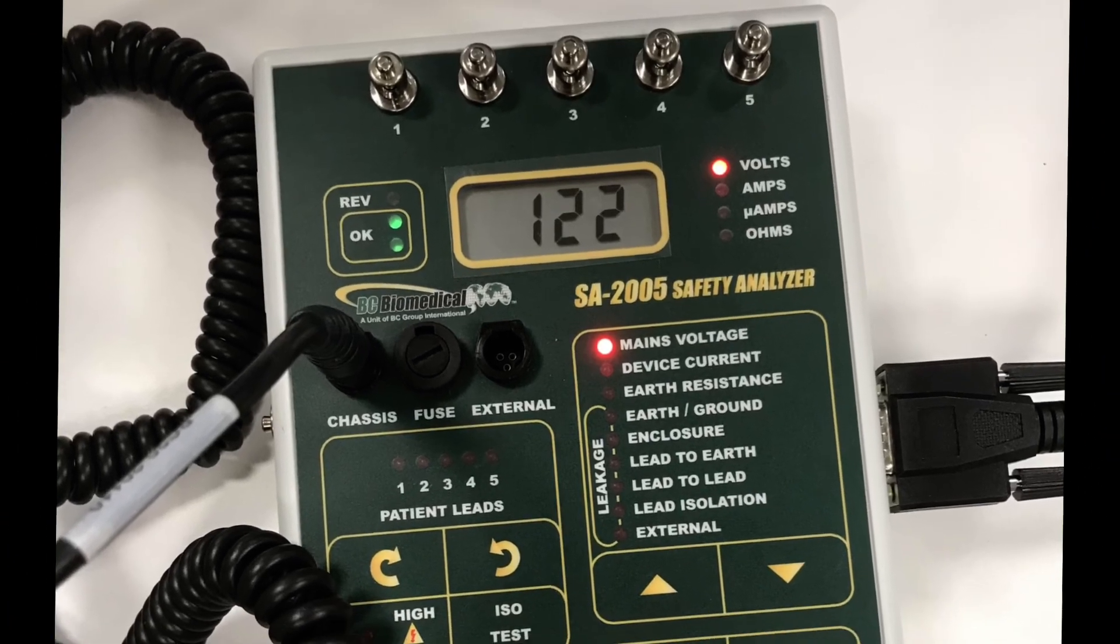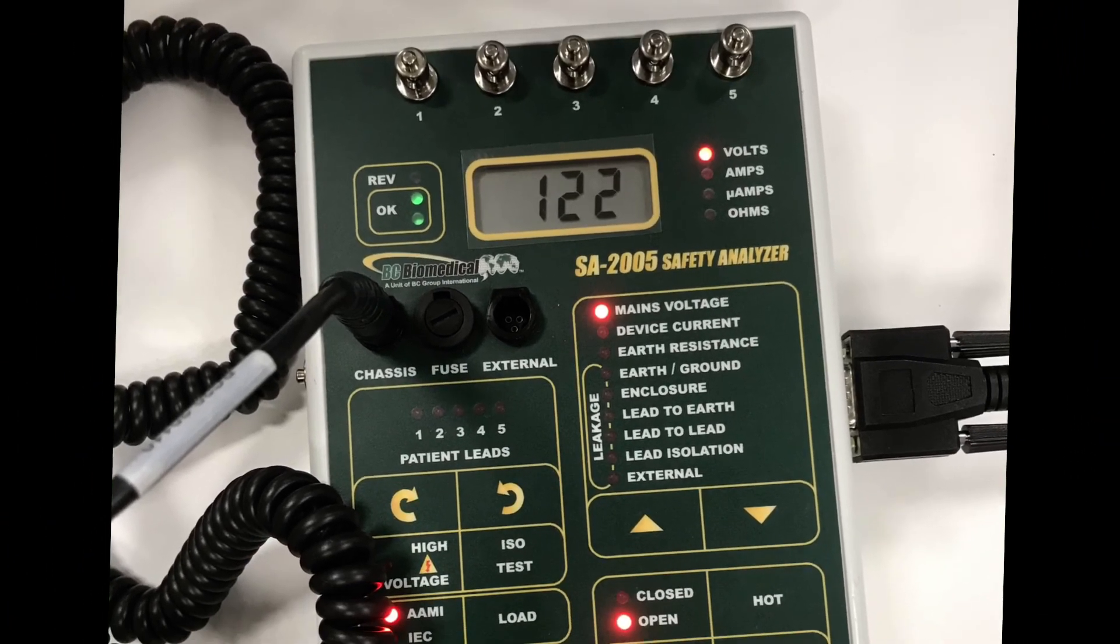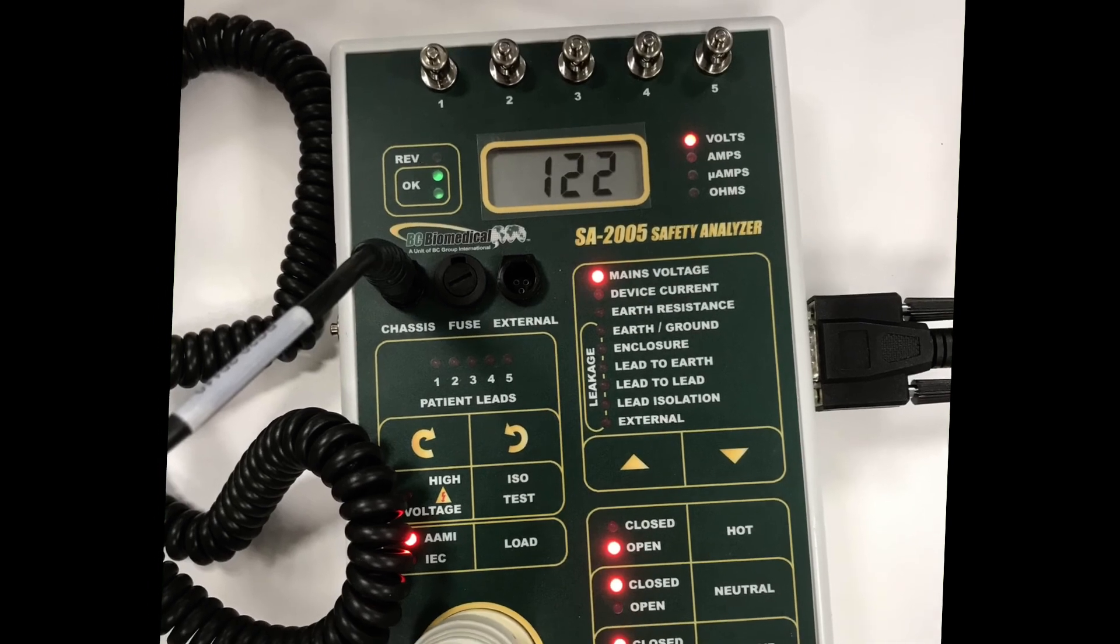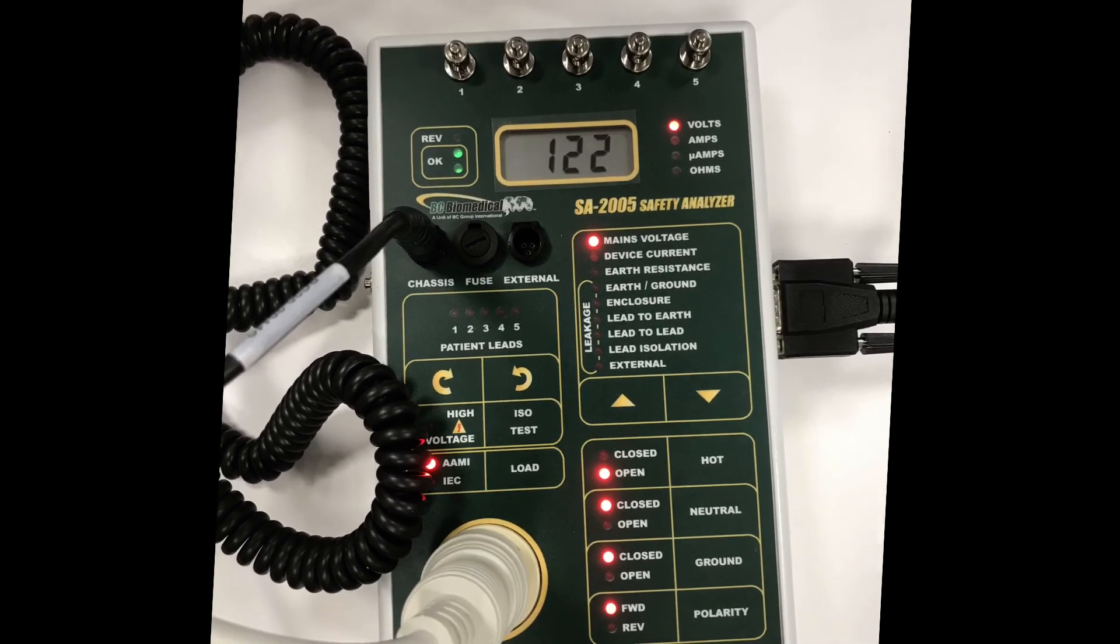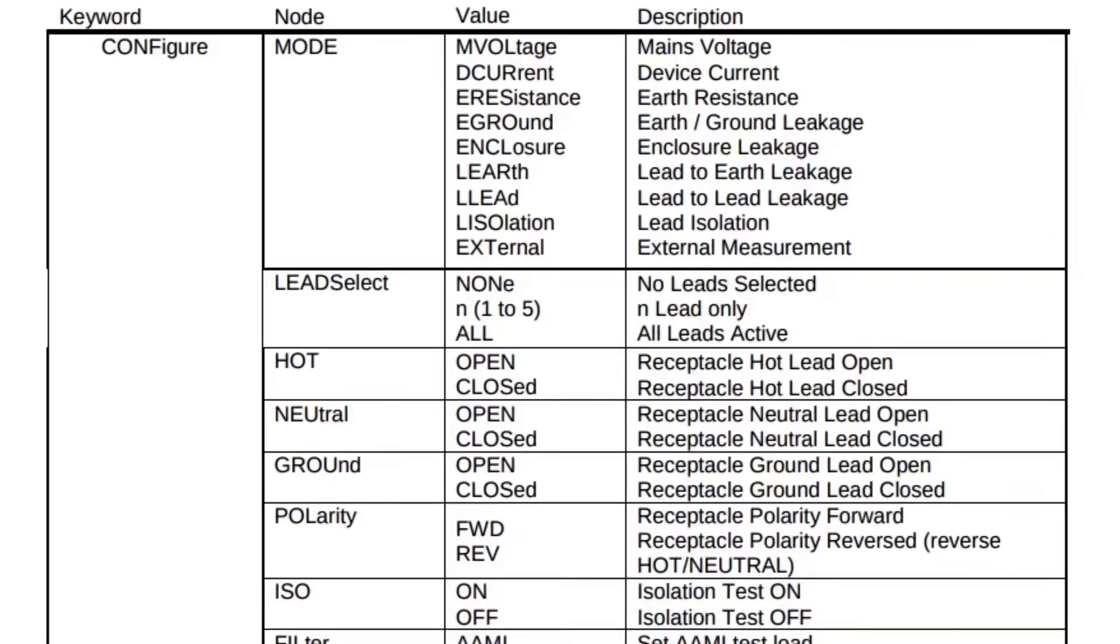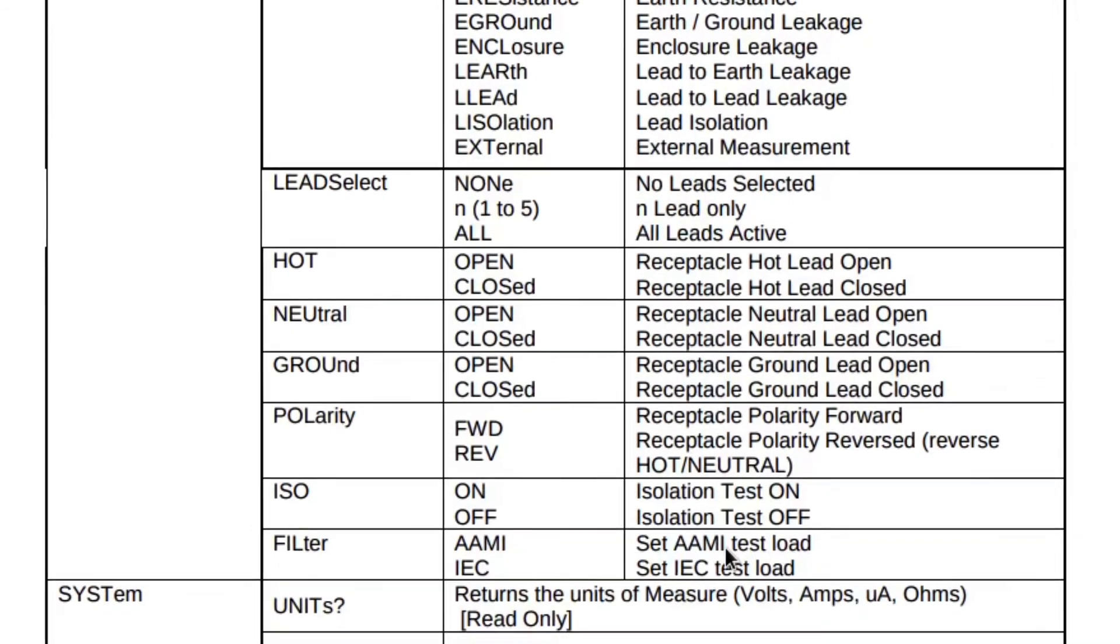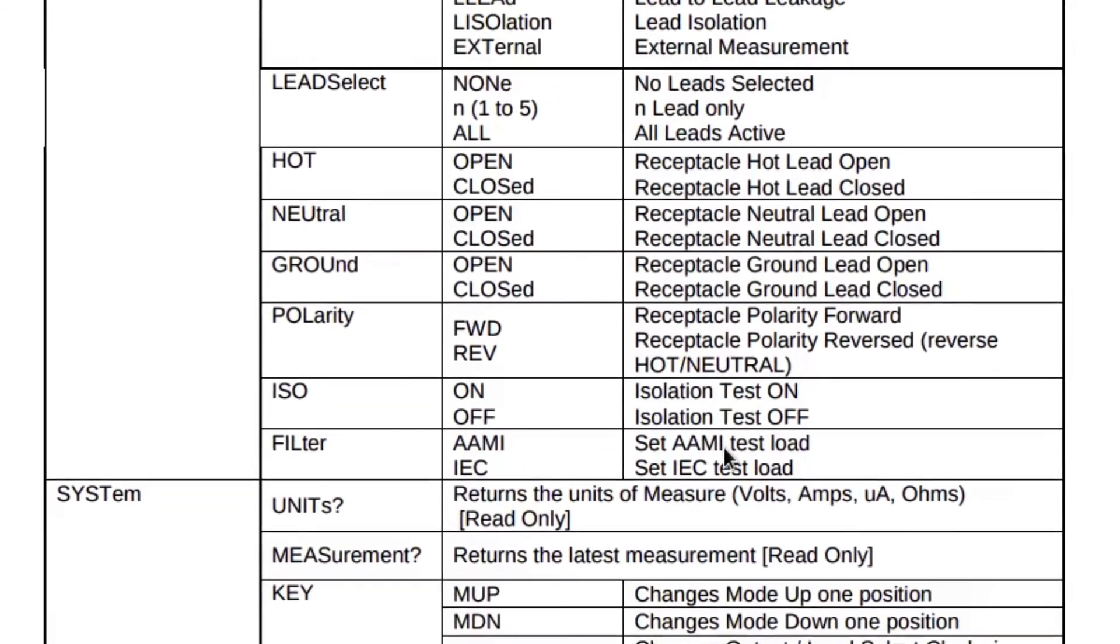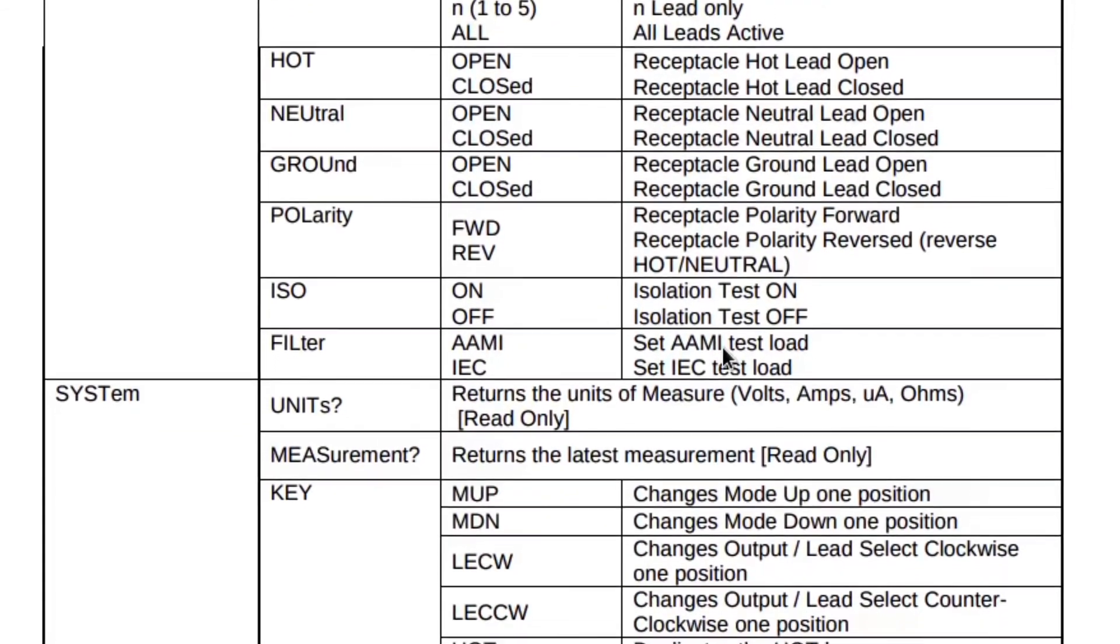One of my projects this year was to try and come up with a way to make the serial interface on the SA 2005 safety analyzer a bit easier to use. Because while it does have a serial interface, it's not exactly that clear on how to use it or how to combine certain commands together.